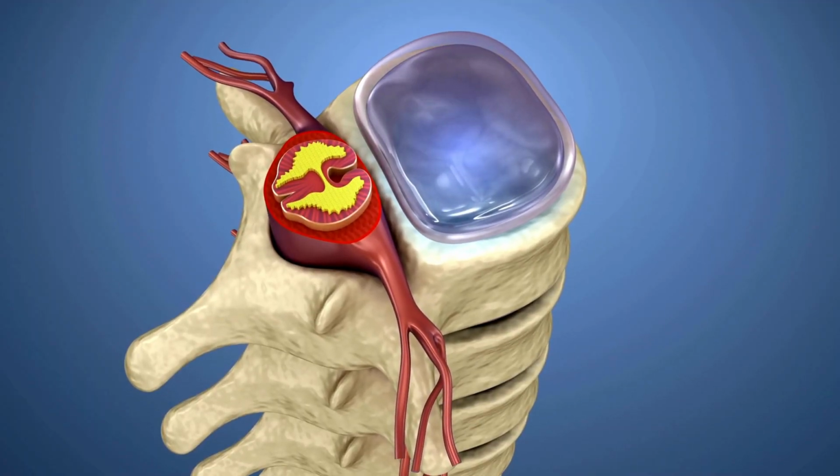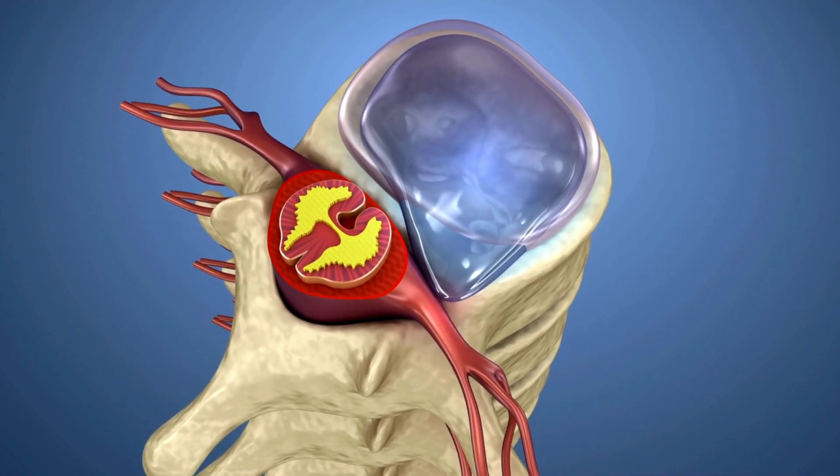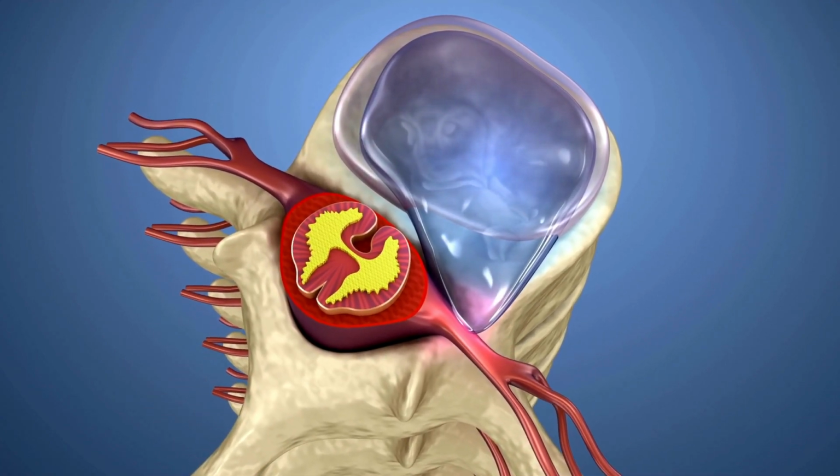And that ballooning, that bulging of the disc material, oftentimes happens in an area of the disc where the nerve root exits out the spine and compresses against that nerve root and causes a lot of pain. So decompression therapy does axial distraction of the spine, actually stretching the spine in a lengthened position.